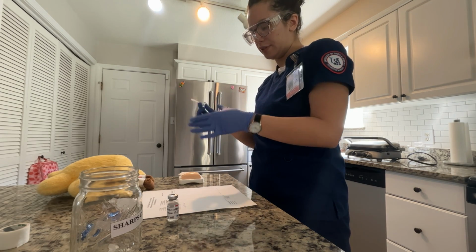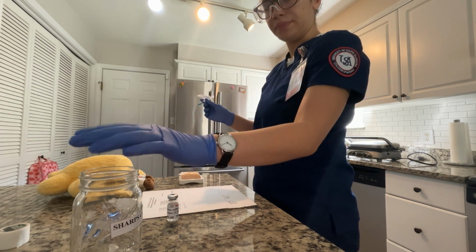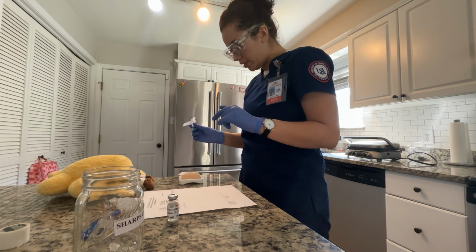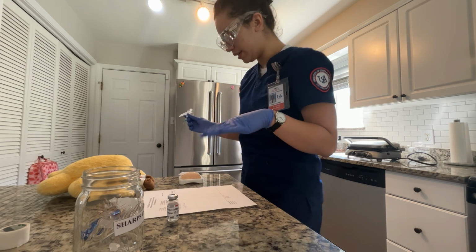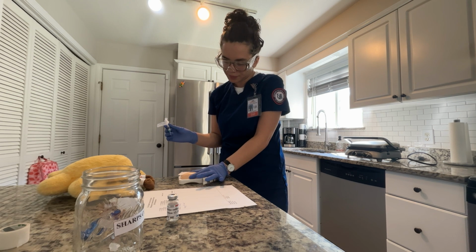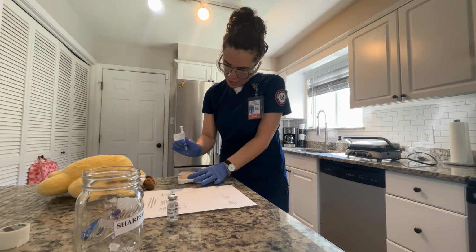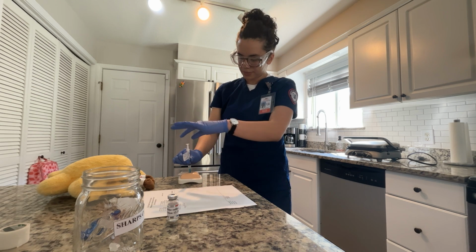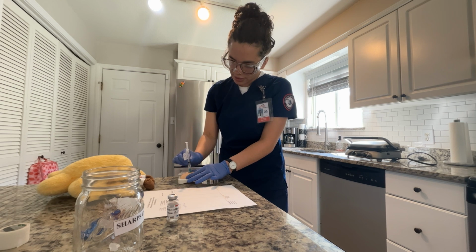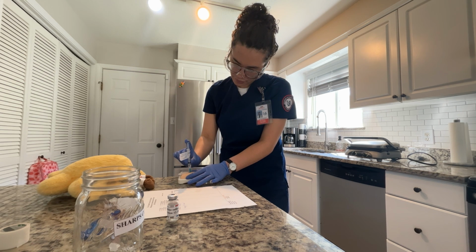Now I'm going to remove my needle cap. Okay, Mr. Jones, you're gonna feel a stick in 3. And when I say 1, you're gonna feel a stick, so I'm going to spread his skin. And now I'm going to, 3, 2, 1. So I'm going to aspirate to check for any blood, and I don't see any blood, so I'm going to inject that slowly.